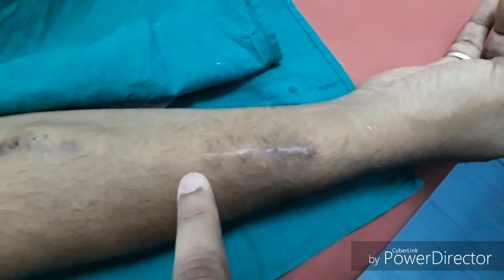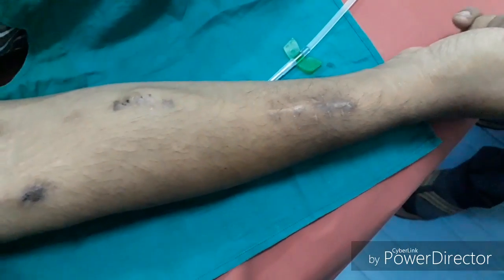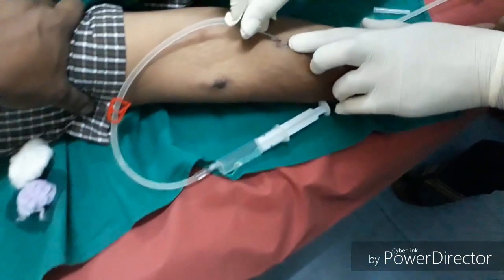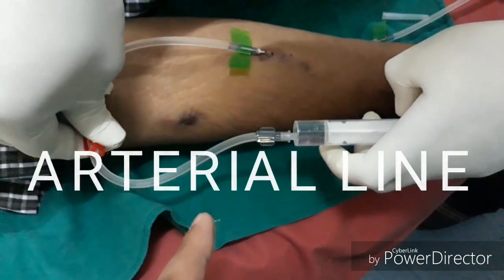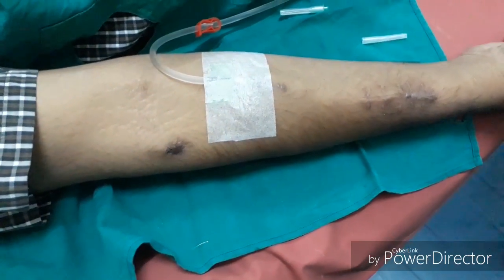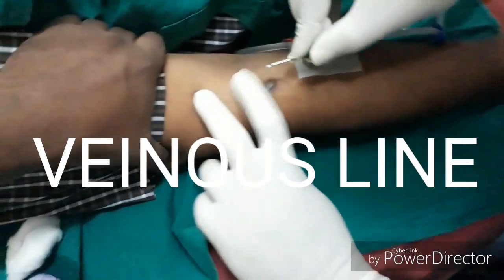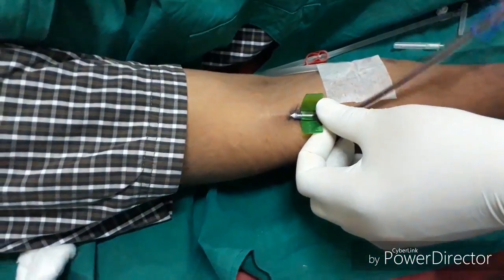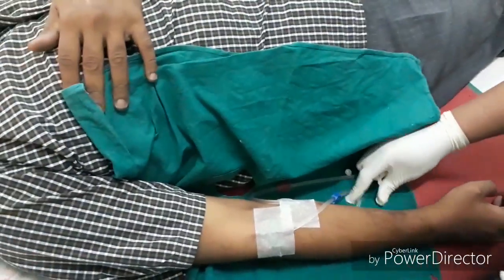In this video, you can see the AV fistula. In the AV fistula there are two pricking points — the first is the arterial and the second is the venous. We are introducing a needle from the arterial line, and then we are securing the venous line. So there are two lines: the arterial line going to the dialysis machine, and the venous line going from the dialysis machine back into the patient's body.